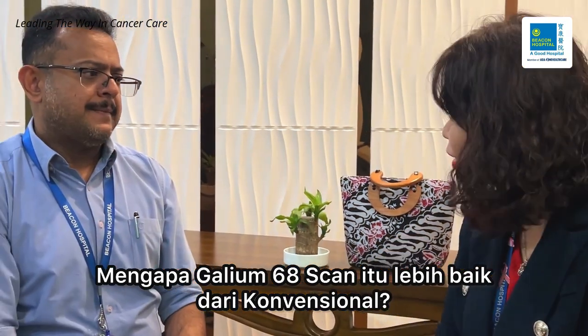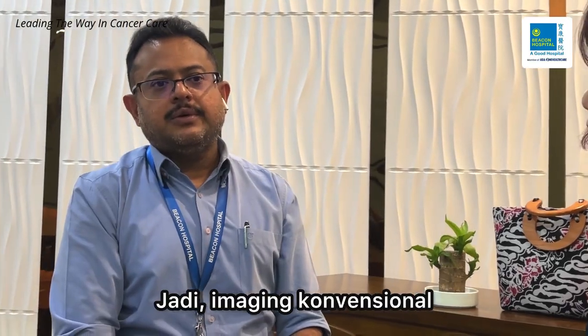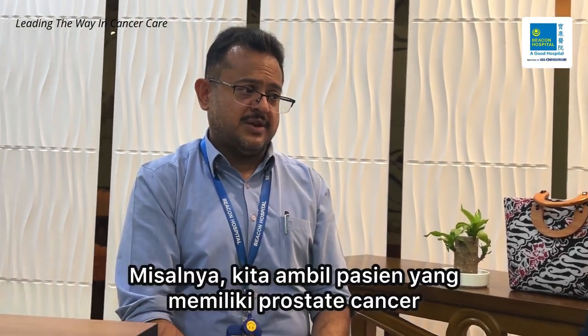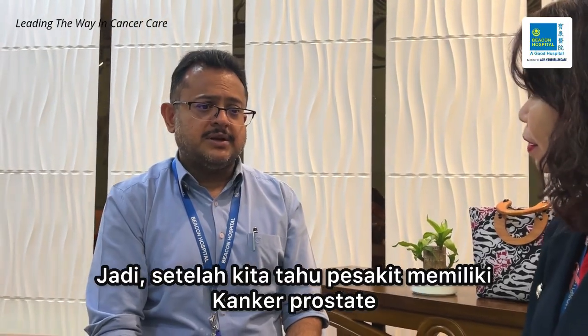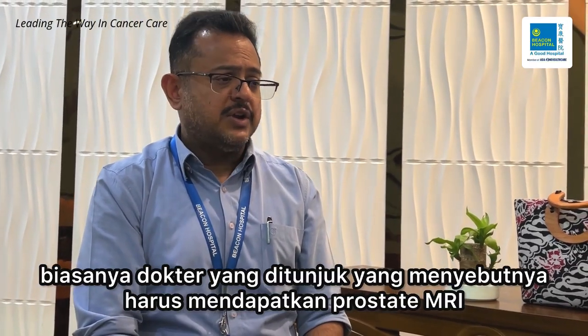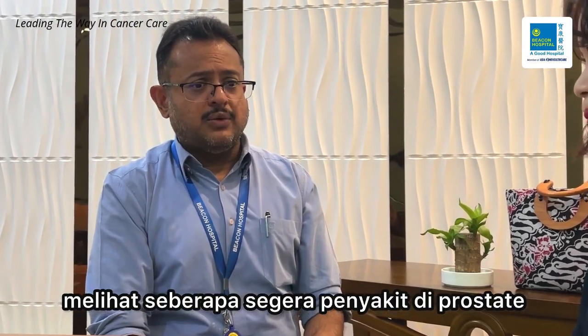Okay, noted, doctor. Why is the Gallium-68 scan better than conventional? Conventional imaging means our routine CT scans or MRI. Let's take a patient with prostate cancer. Once we know the patient has prostate cancer, usually the referring doctor needs to get an MRI prostate done to look at how severe the disease is in the prostate.